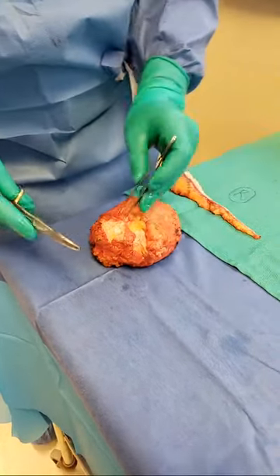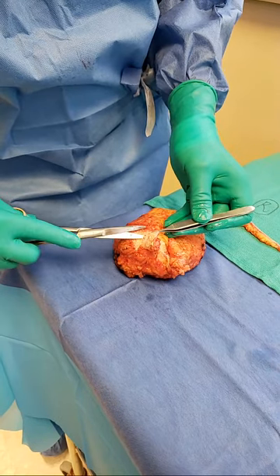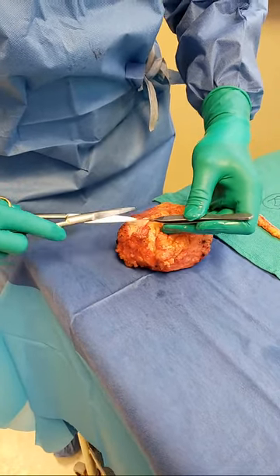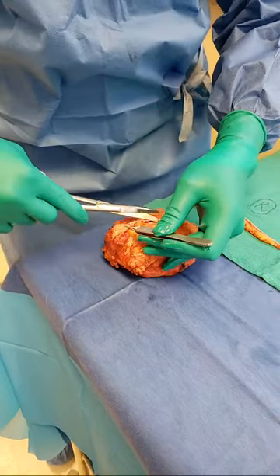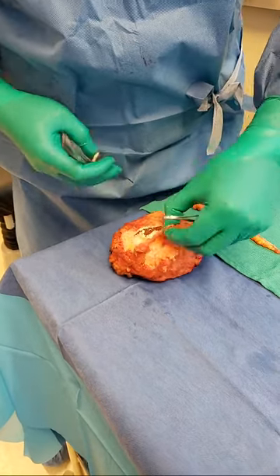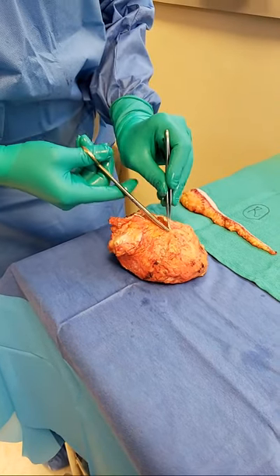I'm going to go ahead and use my pickups now. As I enter — there we go. She's been living with this for, God knows, decades. The whole goal is to let none of this spill into the chest — remember, this is nothing but badness. None of this spilled into the chest. This is the gold standard.